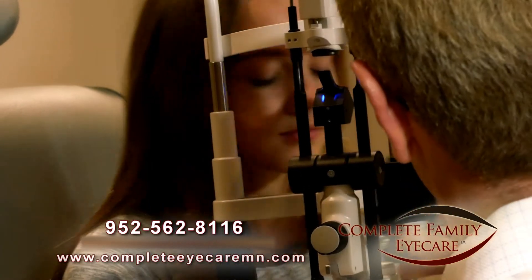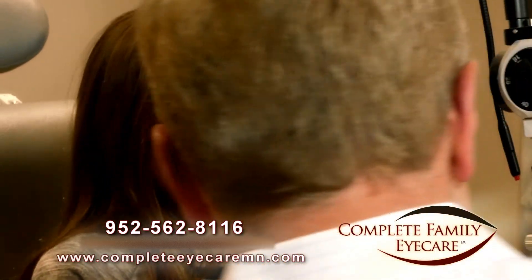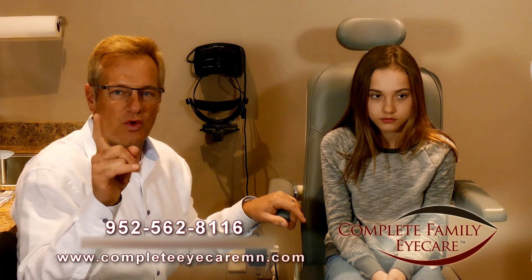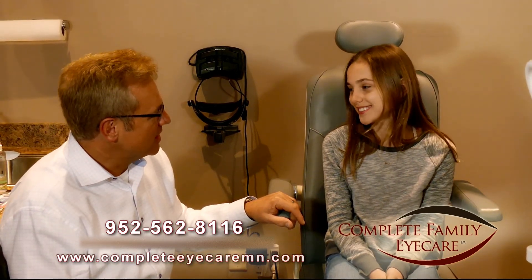Perfect. Go ahead and sit back. Pressure is 16 millimeters of mercury, which is average. And no air puffer. So that's the glaucoma pressure screening test that we do here at Complete Family Eye Care — no annoying air puffer ever. That hurt? No. Piece of cake? Yeah.